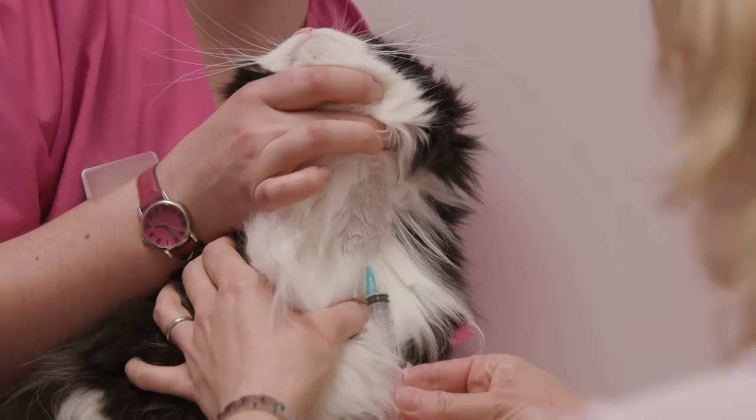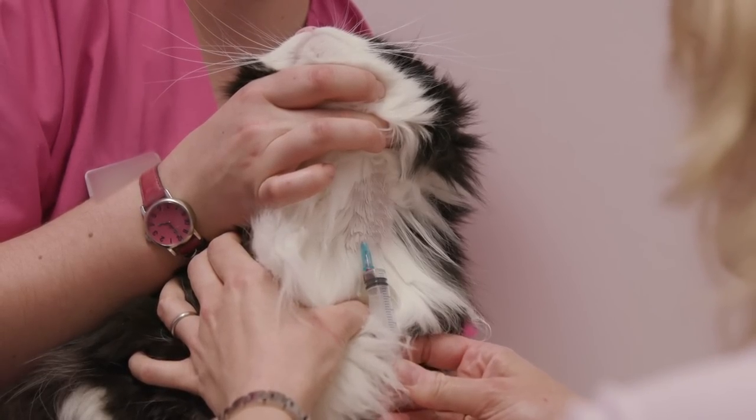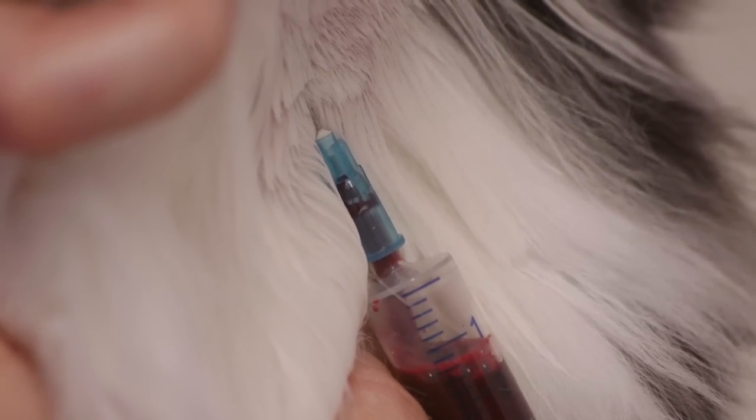For very needle shy cats it can be helpful to apply some topical local anaesthetic cream or to use a local coolant therapy to reduce the sensation of the needle passing through the skin.